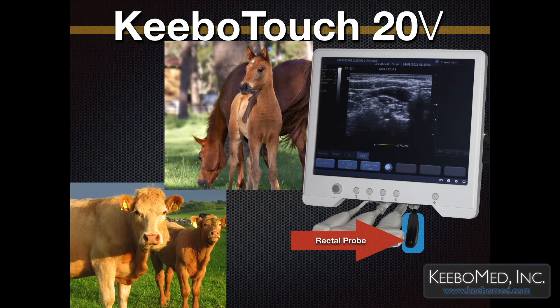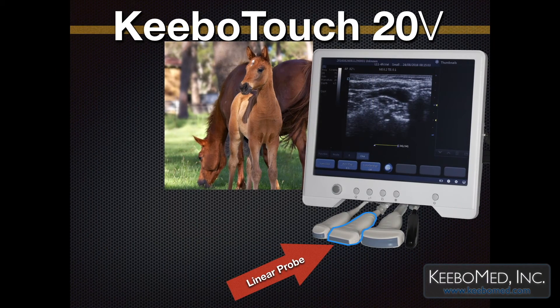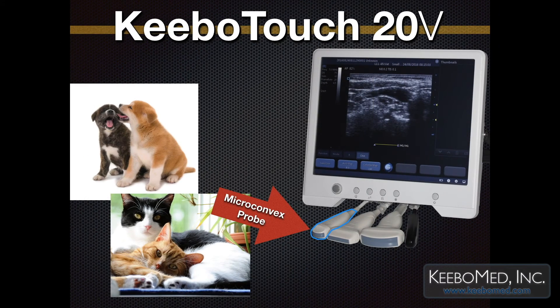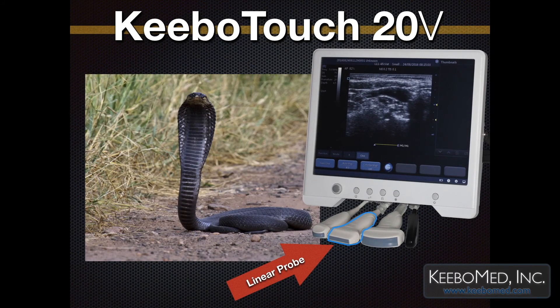KeeboTouch 20V is good for bovine and equine reproduction examinations with the Rectal Probe. The Linear Array Probe can be used for equine tendon examinations. The Micro Convex Probe is recommended for small animals, dogs, and cats. The Convex Probe is good for goats, sheep, and pigs. The Linear Array Probe with a frequency of 5–11 MHz is recommended for reptiles.